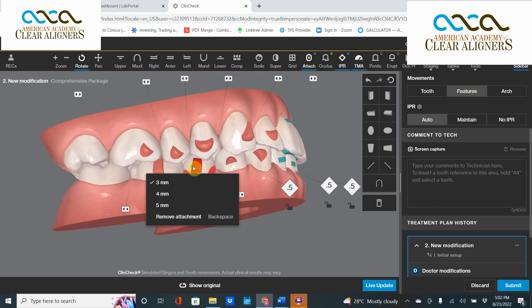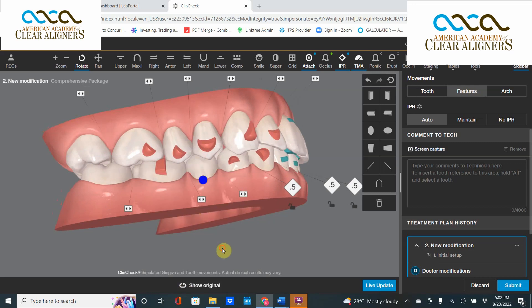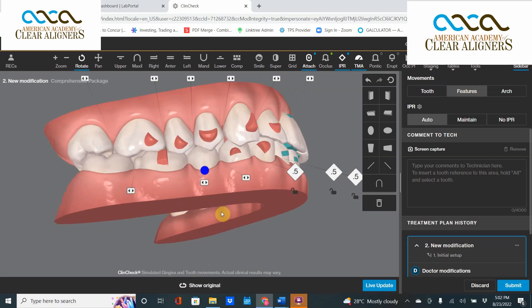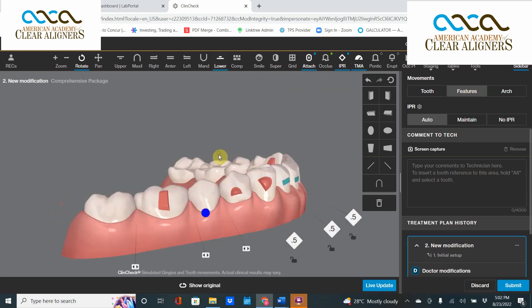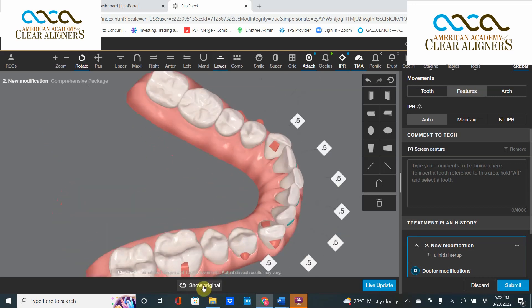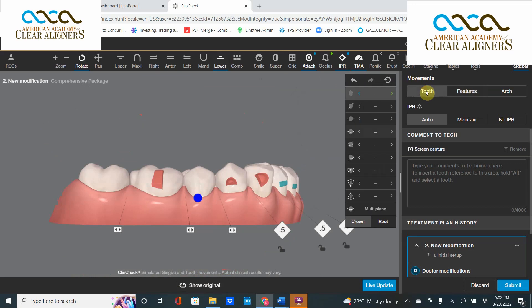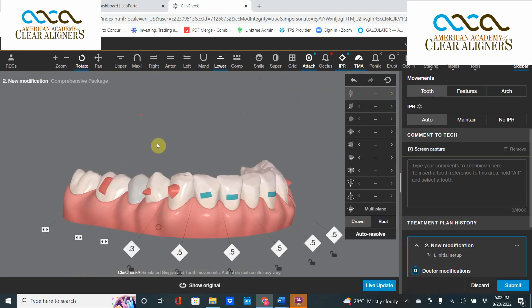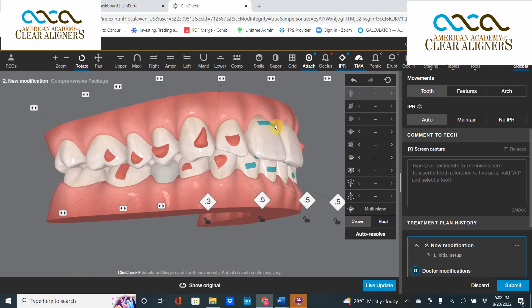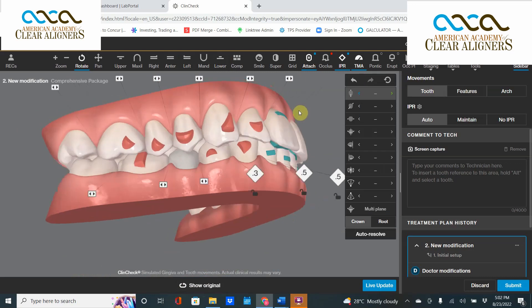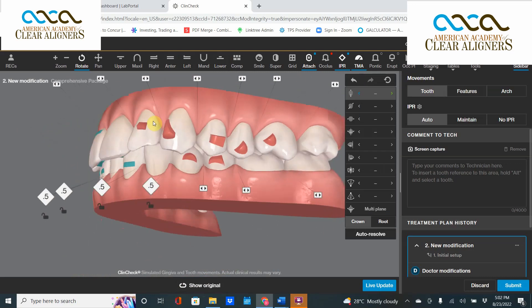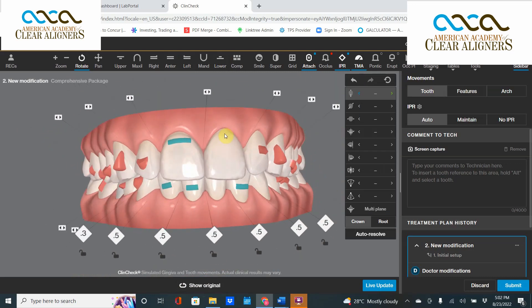She's got to go — there's just no way. Because the movement on that tooth was a rotation, I'm going to make that tooth completely unmovable. I'll go back to the tooth and say I'd like to rotate you, but given your position there's just not enough room for an attachment on it. We'll leave it as is. That is the strategy for removing attachments that are in collision.